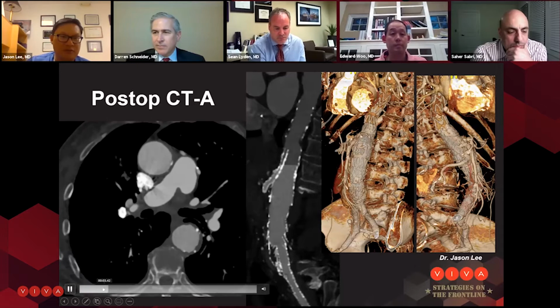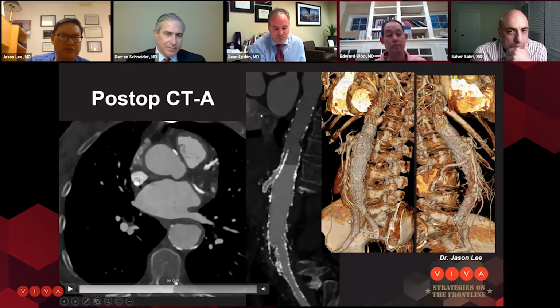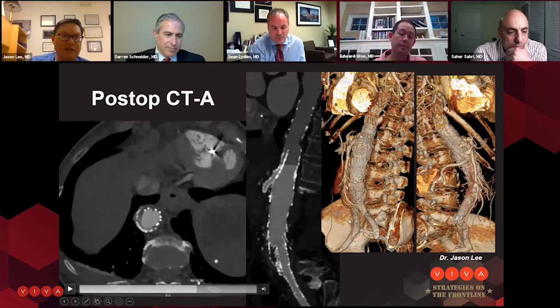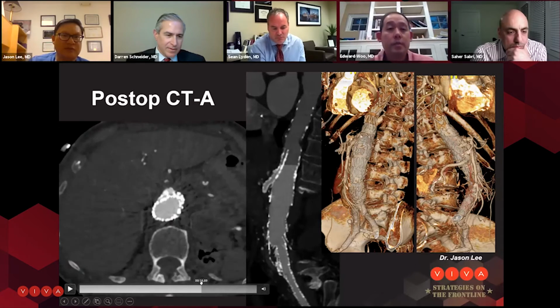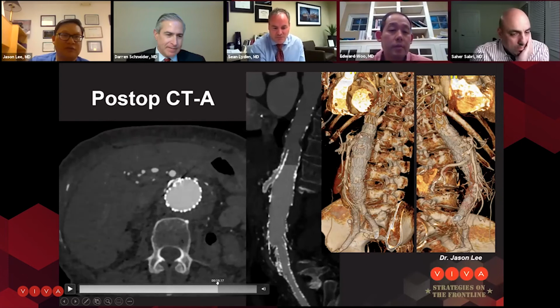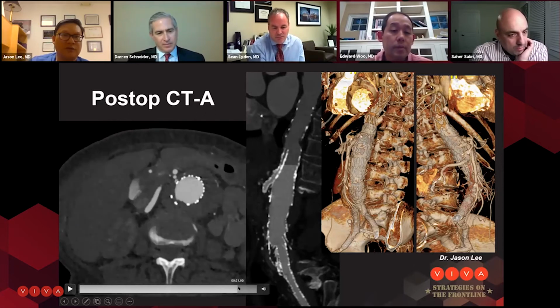Here, I'll slow it down as we get through this, and then the 3D shows it. Nice. So then there's the thoracic piece. It's sealed there. And then inside, right there. So that's the layers of it. And then down, there's the plugged celiac. There's the SMA. And then here's the fenestration for the renal with a flare. And then the renal's filling nicely.